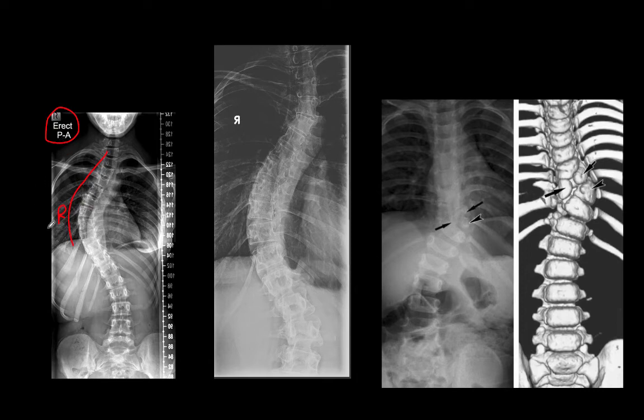These are generally young patients. Remember Risser sign. Risser sign is ossification of the iliac apophysis, and this patient has a very early Risser sign, which means that they're not that close to skeletal maturation. And so what this means for patient care is that you need to monitor their scoliosis until they reach a Risser grade 5, which is, well, really Risser grade 4, which is complete coverage, and then following that, Risser grade 5, which is fusion of the iliac apophysis to the ilium.